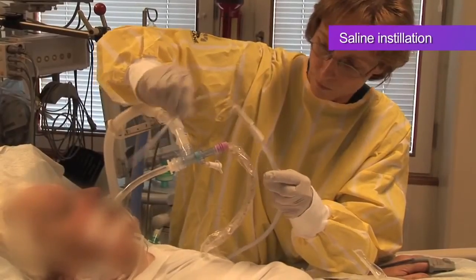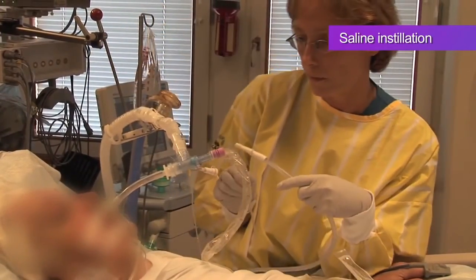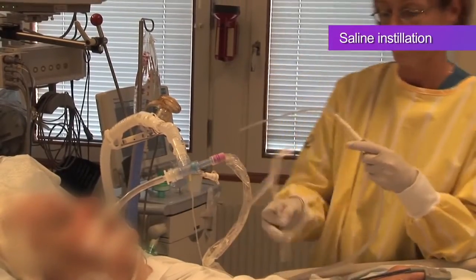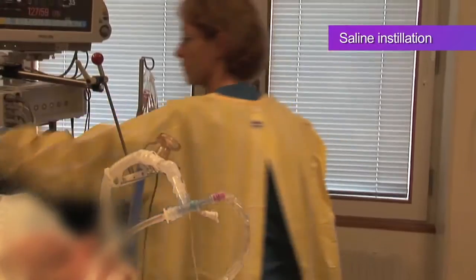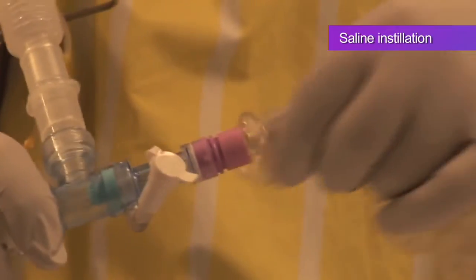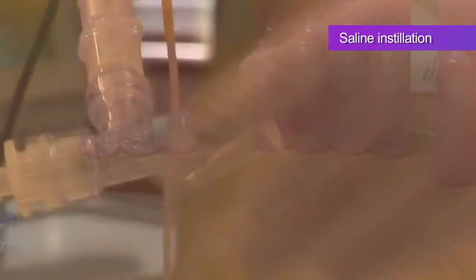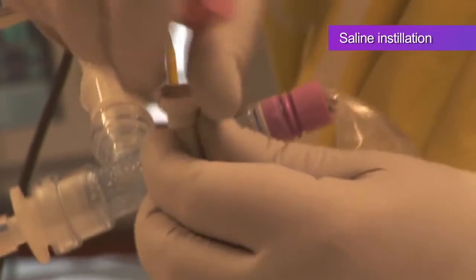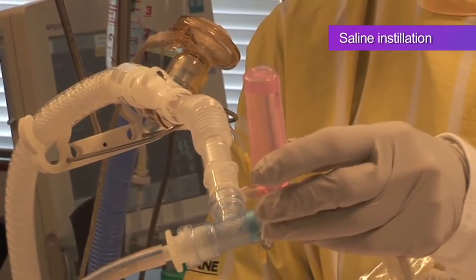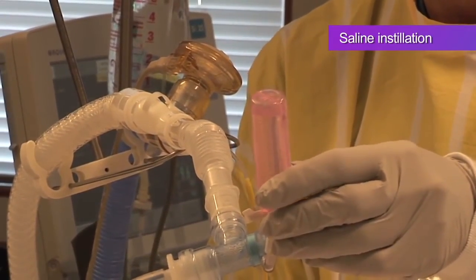Make sure that a collection jar and negative suction are available, and if indicated by hospital protocol, oral care products are at hand. Pass the catheter into the ET tube to the measured depth and connect a saline vial to the cleaning port before performing the suctioning. It is important to time installation of the saline with inspiration to aid the flow of the saline down the ET tube.